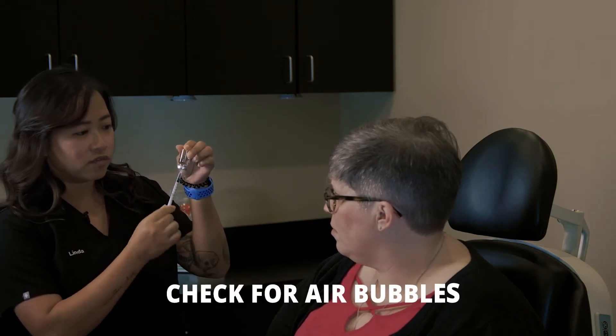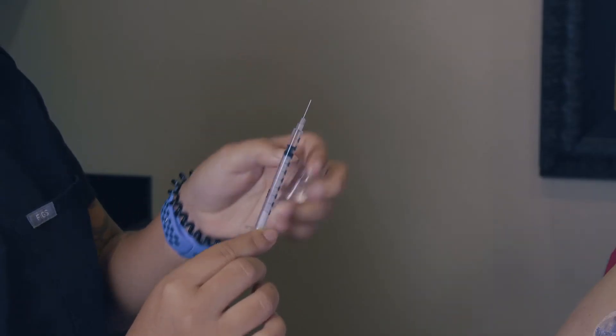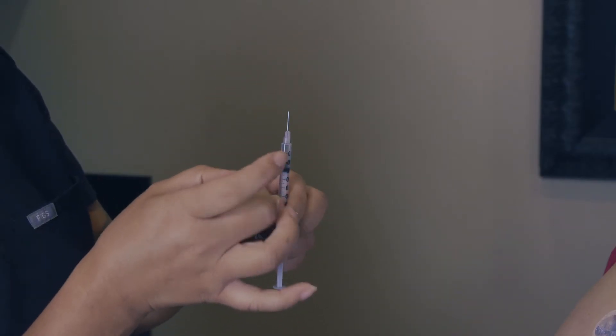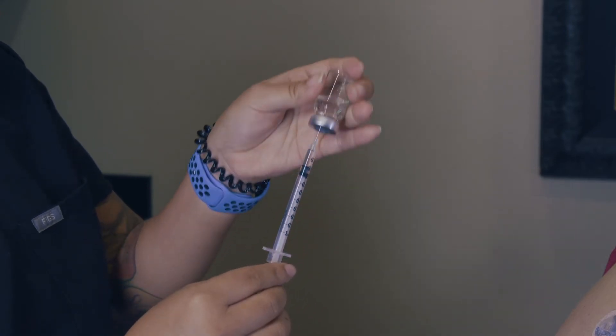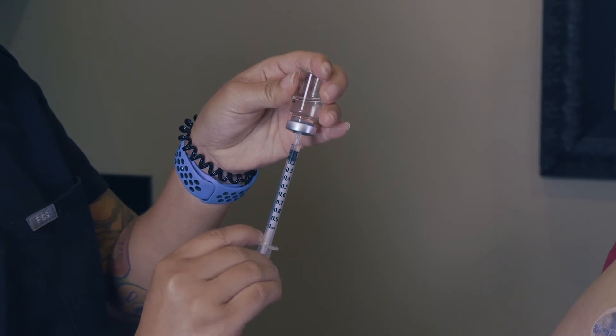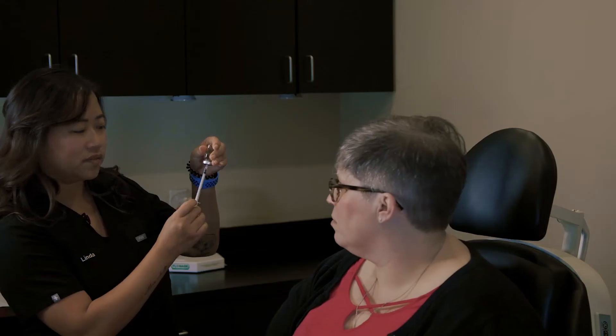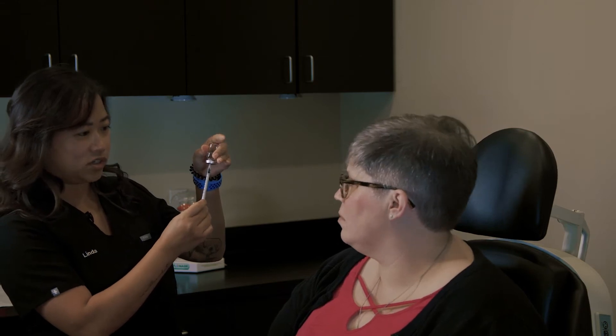Then you will be checking for big air bubbles. If there are any big air bubbles, you're going to pull your needle out, flick it, get all the air bubbles to the top, put it back into your vial, and then you're going to dose it to your actual dosage, just to make sure there's no air bubbles in there. If there's no air bubbles, you're ready for your injection.